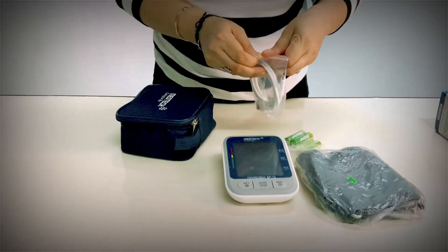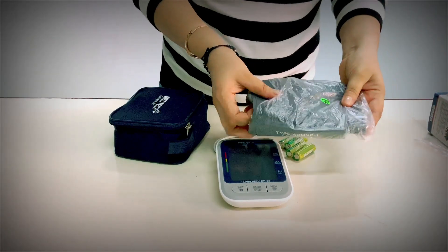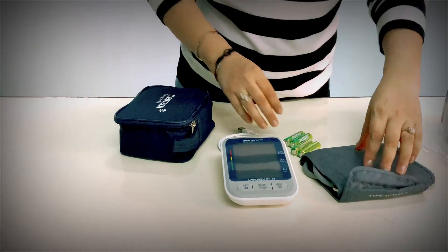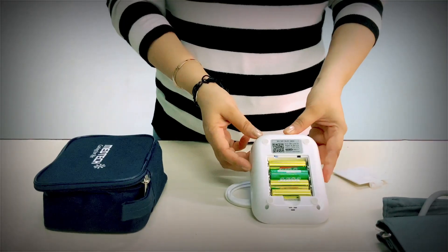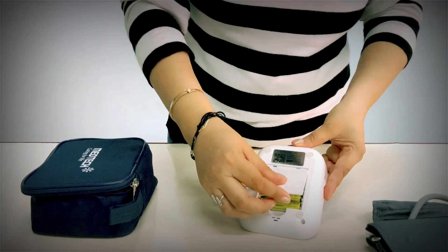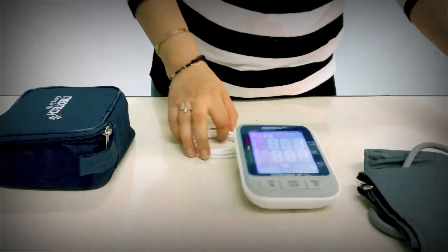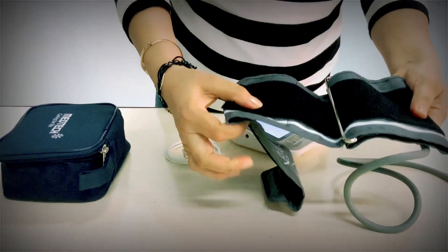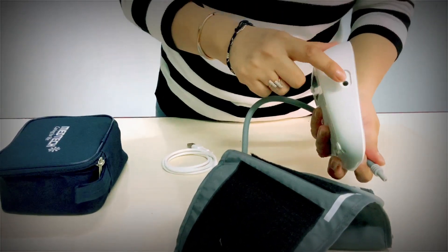If you don't use batteries, then you can charge the digital monitor with the help of this. You can charge the digital monitor. Place batteries like this. Connect the cuff with the digital monitor.